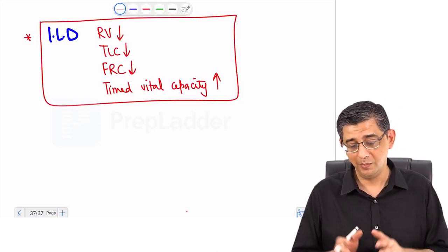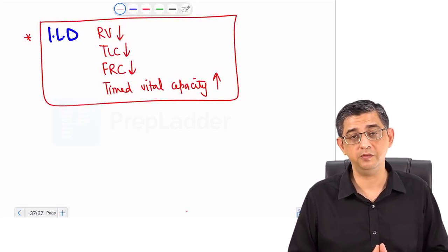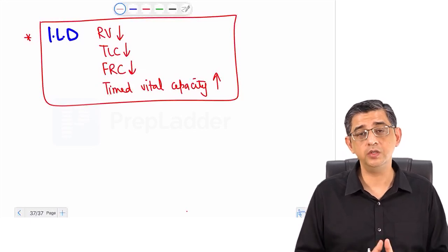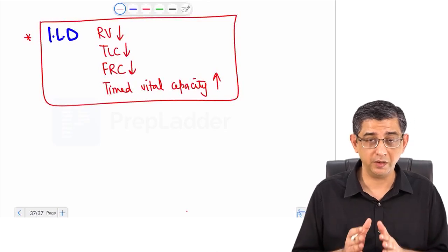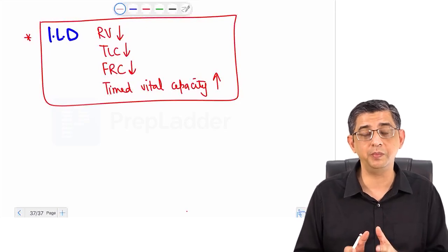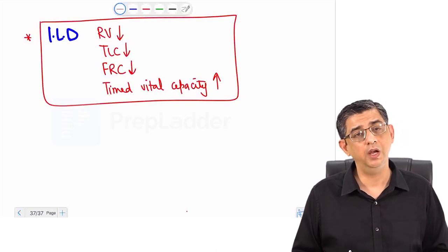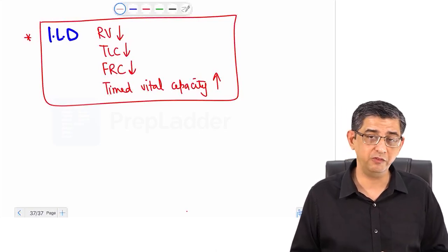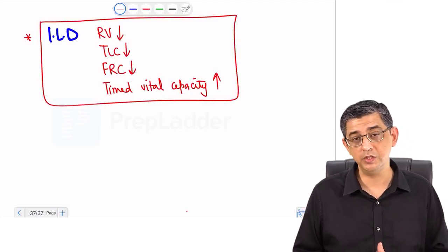That's a separate issue. But the point is, most of these spirometric parameters are very simple and very straightforward. It is just that the orientation of these and the ability to work out faster is what really matters. So it's not only about accuracy, it's about speed as well, especially when it comes to questions based on spirometric parameters. And flow volume curves, I have hand drawn them before you. If you can just follow them, then I think you would definitely be able to increase your strike rates.